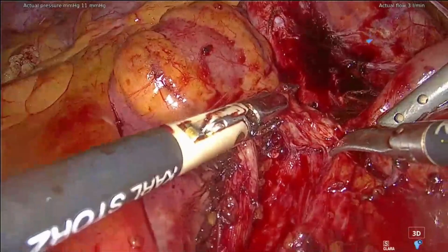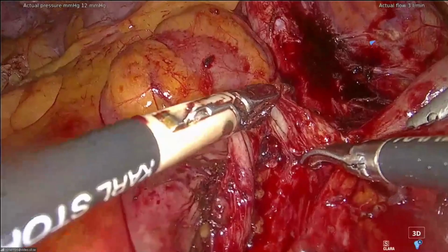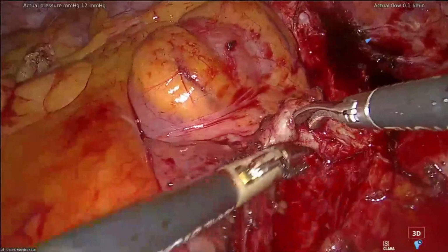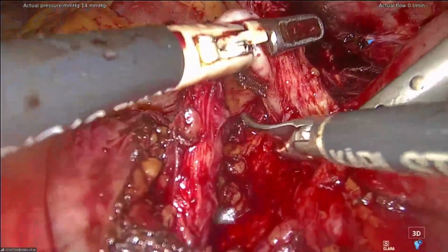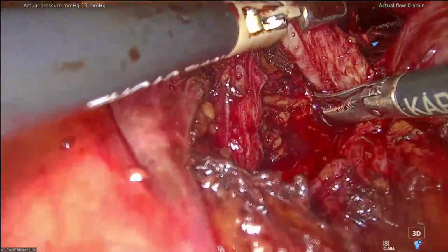For me, I prefer to redo directly, because if it doesn't work, it's always the same. You have to think about if it works and if it doesn't work, what is the percentage of failure? But if it doesn't work, we will be in very hard scar tissue. Because when we do an endoscopic procedure, we have to cut the wall completely, and we create somewhere an iatrogenic urinoma.